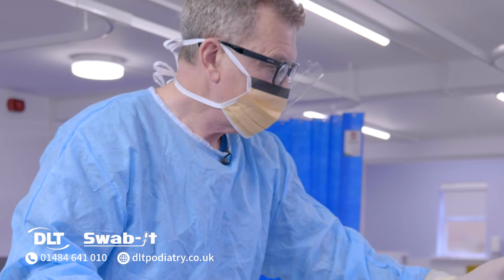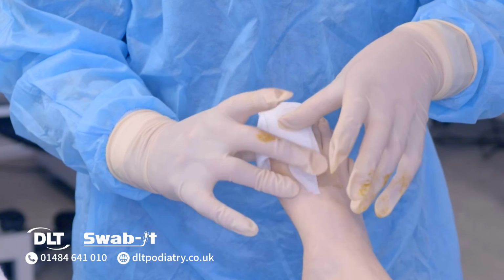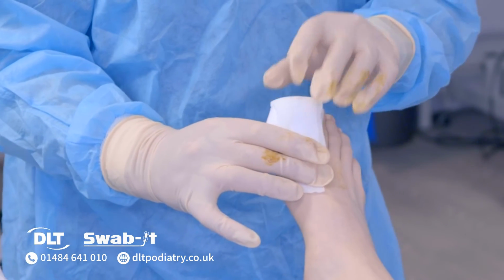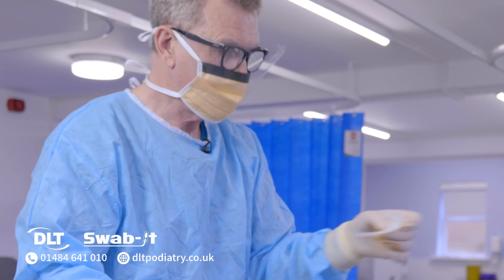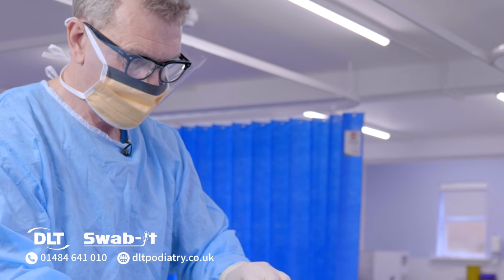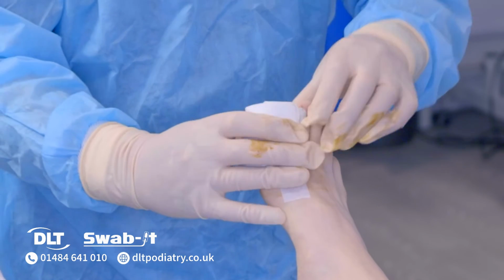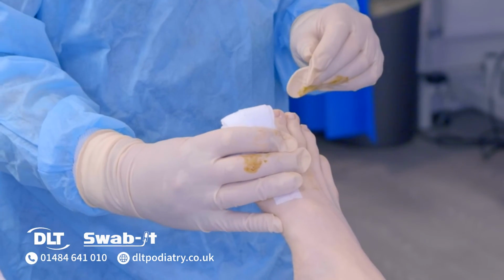Right, I probably need 2 strips, one for there and one for underneath the foot. Yeah, please. Have you got the large tube gauze? Yeah. And I'll just have one more piece of Mefix, please.